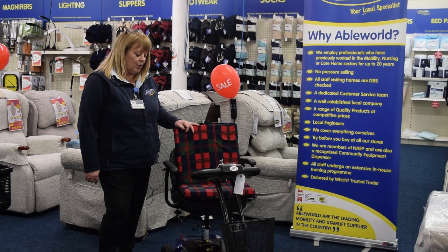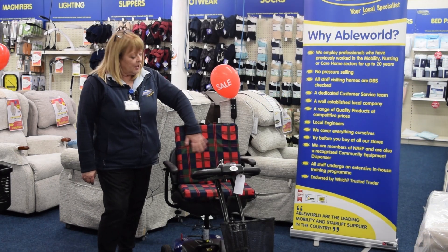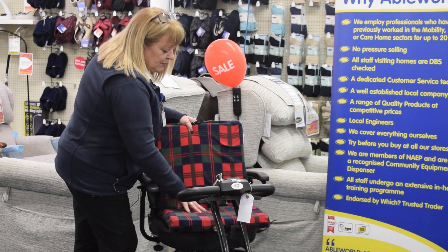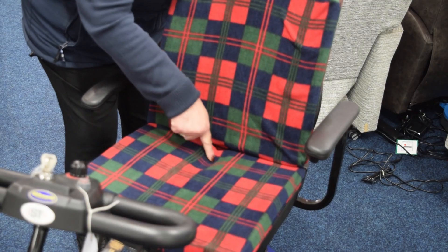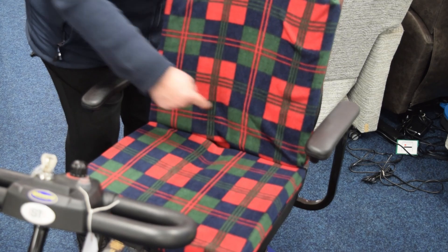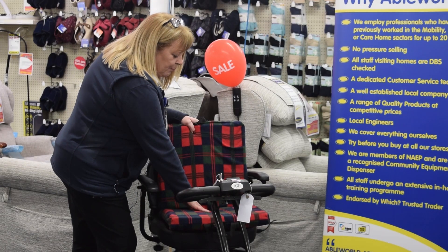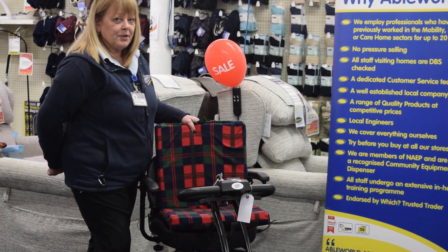The two-way support cushion comes in a soft-touch tartan fabric. The cushion has a cutout on the lower part of the cushion, which is the one that you sit on, and the back part of the cushion has a cutout as well, so it will relieve the pressure off your sacrum area and the lower part of your back.